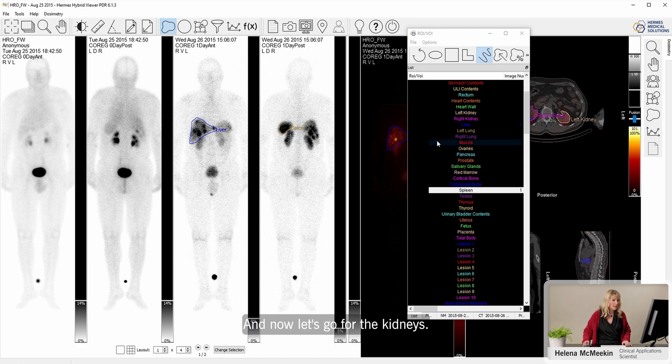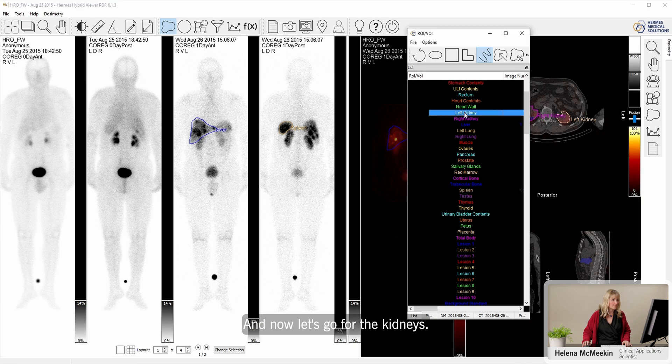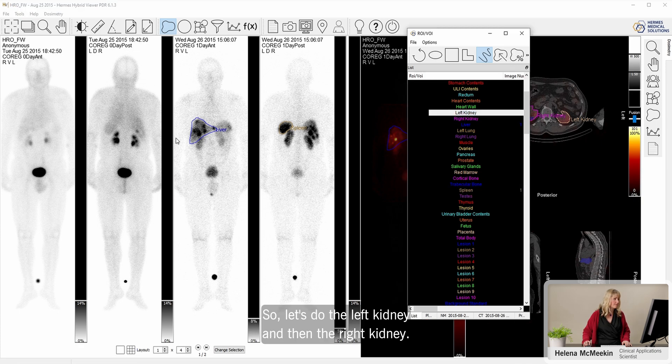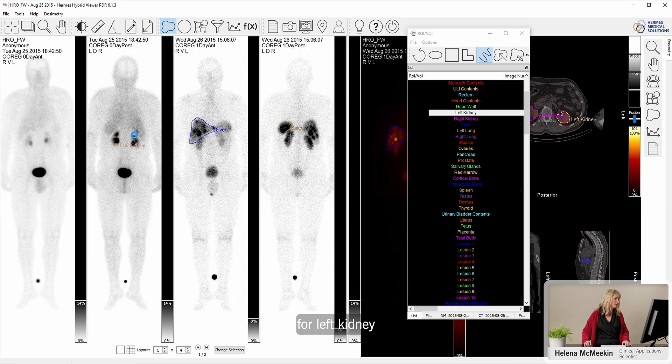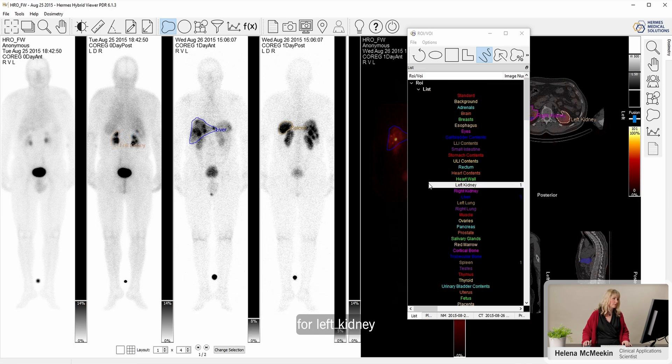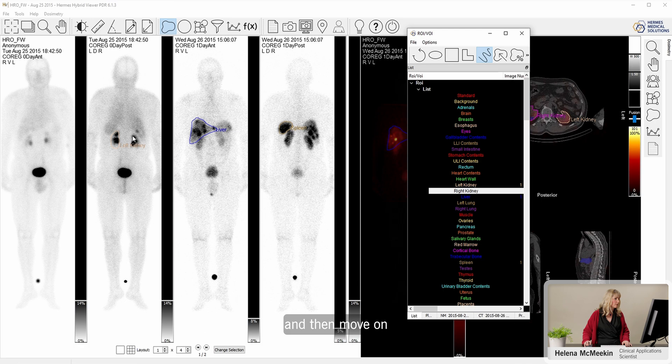And now let's go for the kidneys. So let's do the left kidney and the right kidney. I'm just going to use this time point for the left kidney and then move on for the right kidney.